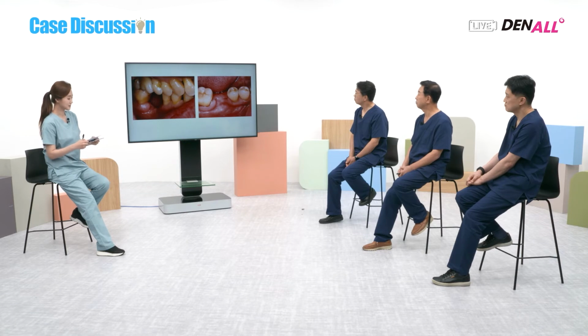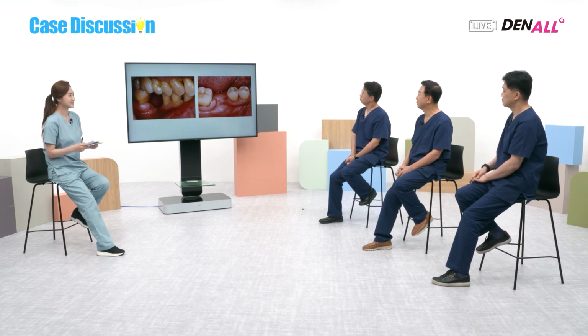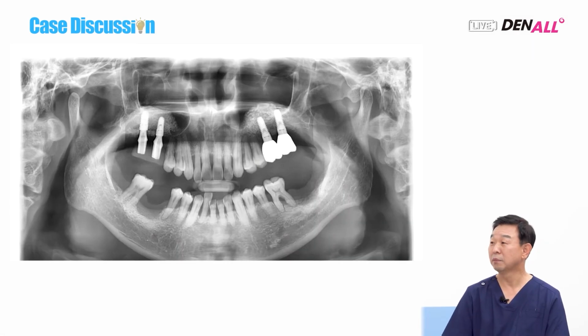So you're looking at the case. What do you think? Dr. Jeong Jong first. In this case, teeth were extracted 5 months ago. Soft tissue is healed enough, no problem there. On the panorama, the vertical bone is severely resorbed.